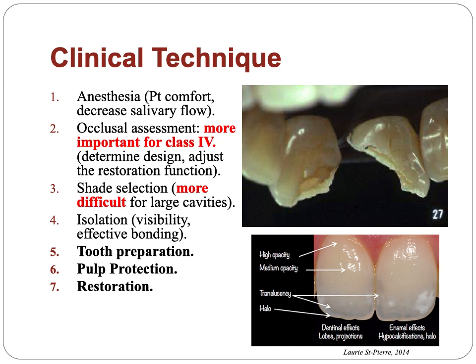As you see in the first picture, most of the tooth is missing, so this will make a complication for us if the patient has opposing occlusion that, for example, has tilted teeth. So those tilted teeth will take some of the space that we will place our restoration in that area.